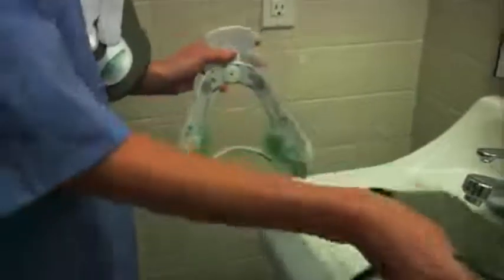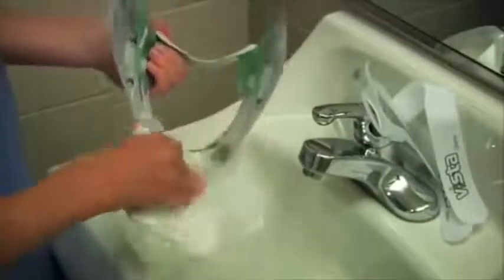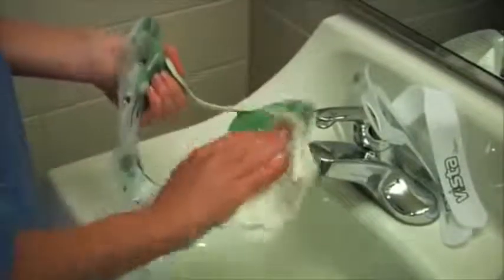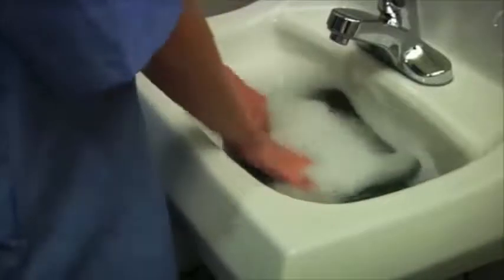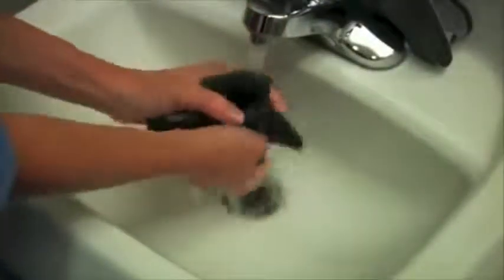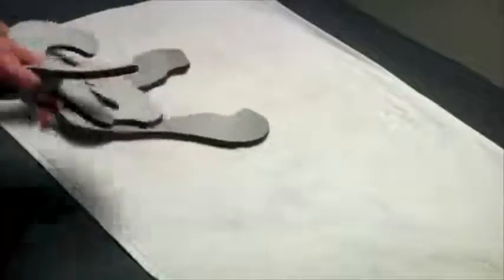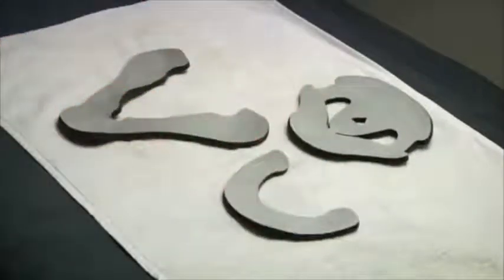Remove the pads from the product by peeling them away from the Velcro dots. The plastic shell may be wiped using mild soap and water. Rinse and towel dry before reattaching the pads. Hand wash the pads with mild soap and warm water, rinse thoroughly, and allow to air dry. Do not use heat to dry the pads. Replacement pads may be used while the pads are drying.